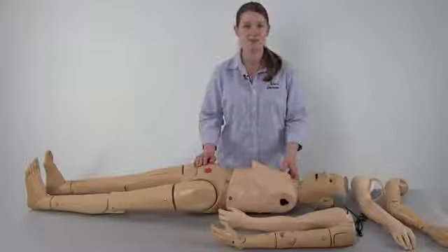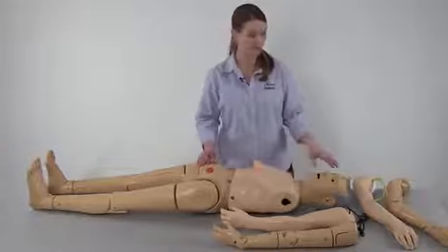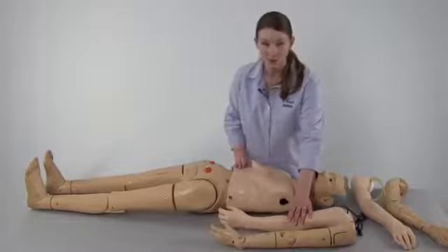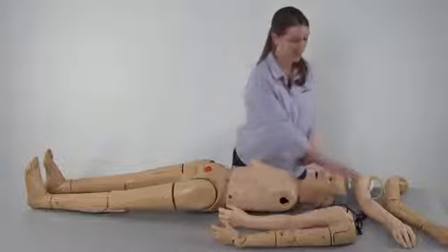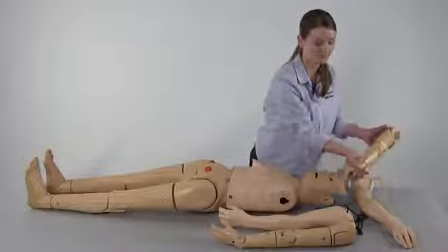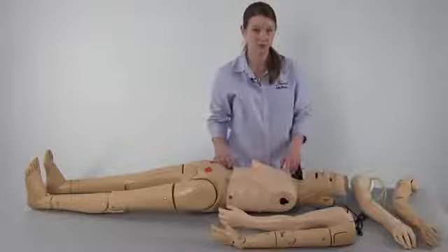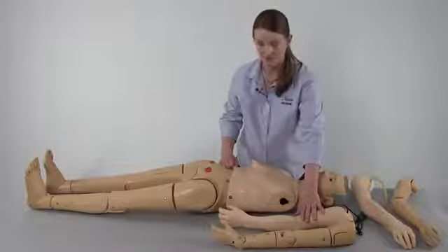The most advanced version of the elderly appearing Jerry or young appearing Carrie comes with four arms: the left blood pressure arm, a left articulating arm, a right intravenous arm, and a right fully articulating arm. For the purposes of this instructional video, we're going to attach the intravenous arm and the blood pressure arm.